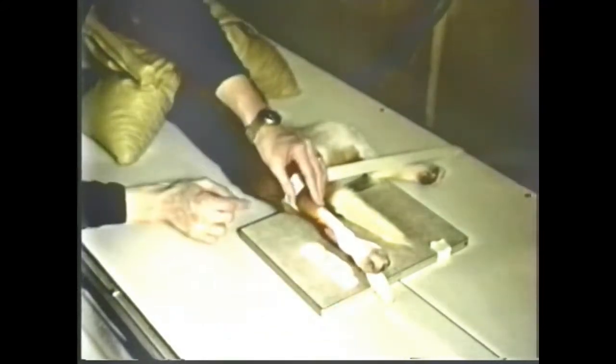It is sometimes difficult to maintain the contact of the foot with the cassette, and so additional tape and positioning may be necessary. The marker is placed on the cassette. Ready for exposure.